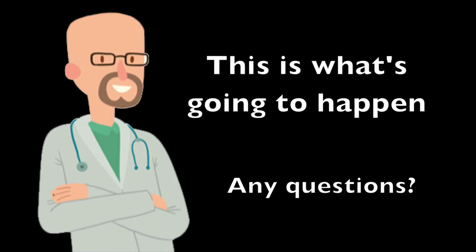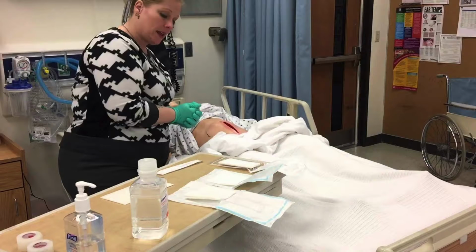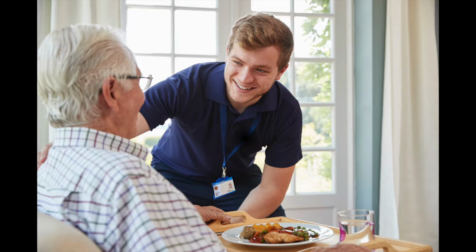The student will introduce him or herself. It is not essential for a clinical supervisor to be present for this non-invasive clinical procedure on a simulation model. The student will explain the procedure for sterile dressing change and the steps involved as if the simulation model were a patient listening. For example, "Hello, my name is Joseph. I'm one of the medical assistants here in the clinic today. Can you tell me your name and date of birth?"